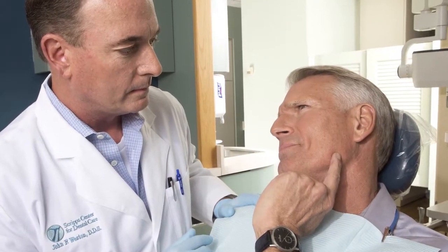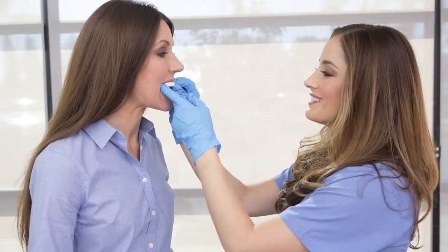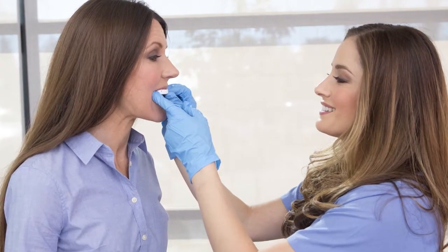I also make QuickSplints often for patients who come in and have suddenly started to experience acute jaw pain or muscle pain. They show up because they yawned too wide or opened up to eat something bigger than expected, and all of a sudden they're having jaw or joint pain. Being able to put them in a QuickSplint and give them instantaneous relief from their acute symptoms while we're sending records to the laboratory is just an unbelievable practice builder, patient rapport builder, and a great service to offer patients.